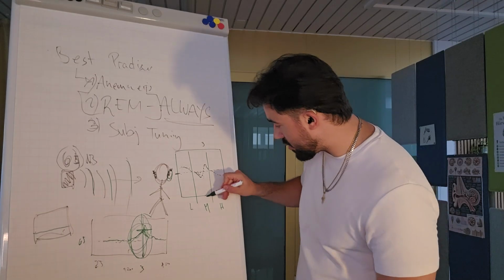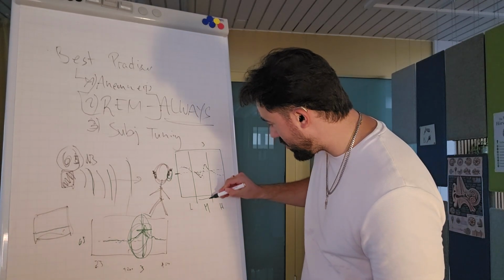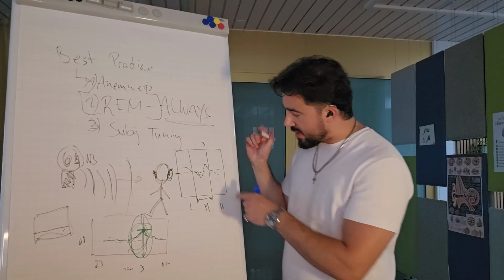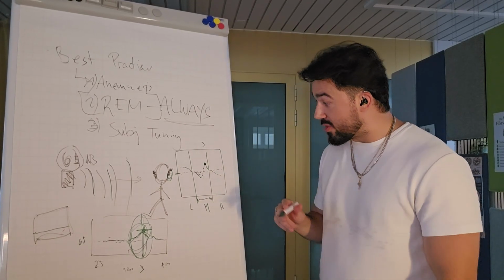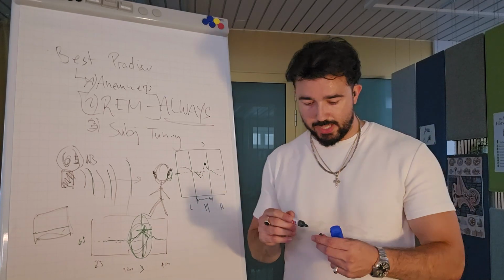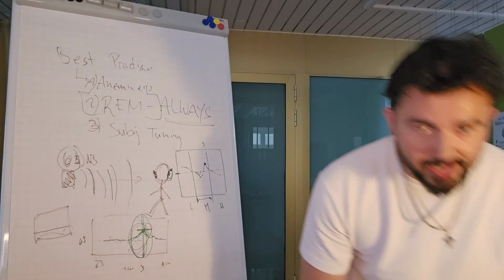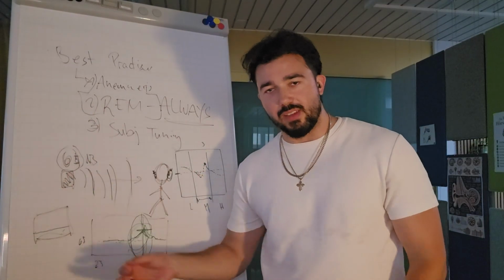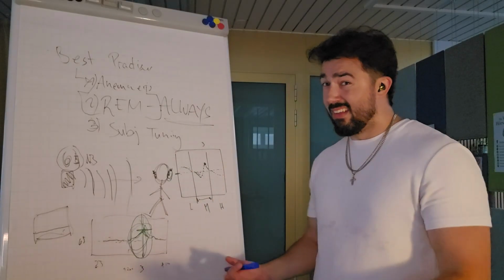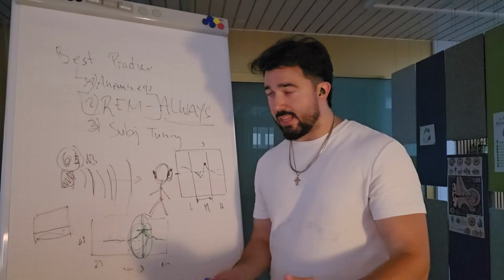When you only have 3 sliders, your slider would affect this whole region. You're thinking, oh damn, it sounds too tinny because this is too much. So you reduce the amplification, if at all you get to the point where you realize, oh, I gotta reduce my middle frequencies because it's too loud. Have fun figuring that out first.